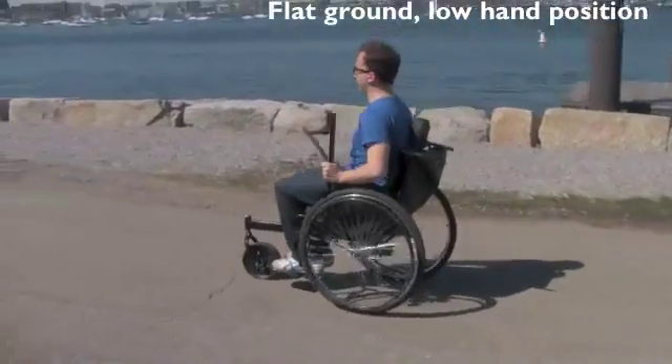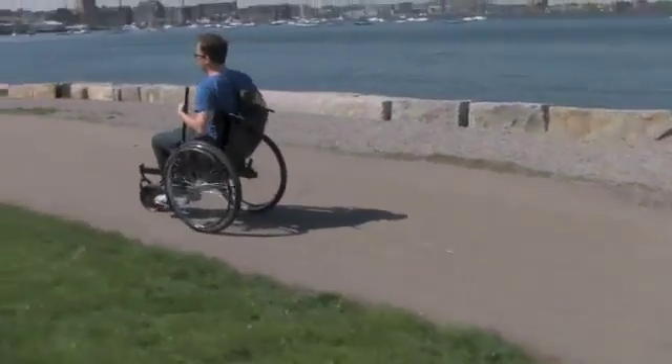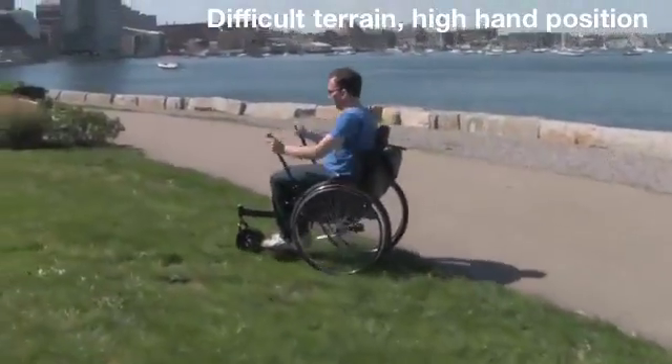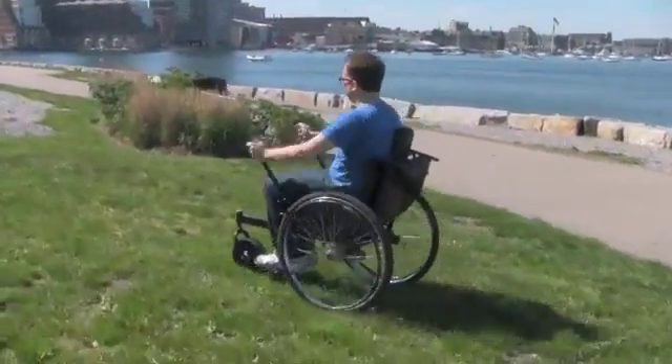On flat ground, place your hands low and push through a large angle to move quickly. On difficult terrain, slide your hands up the levers to get more torque at the wheels.